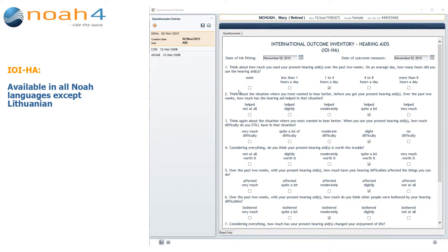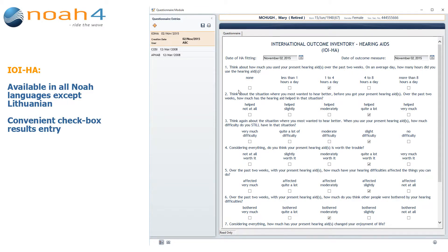The IOI-HA Questionnaire is available in all NOAA languages except Lithuanian. This questionnaire offers a convenient checkbox mode of entry.